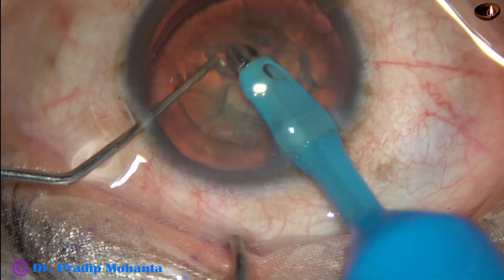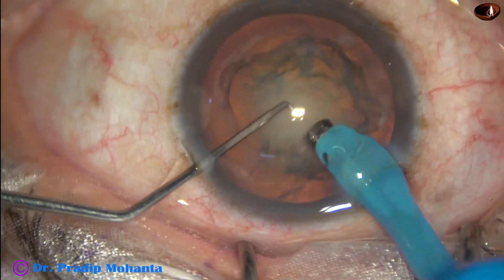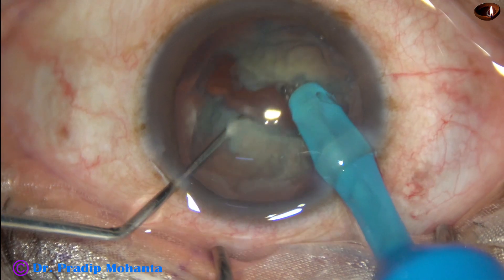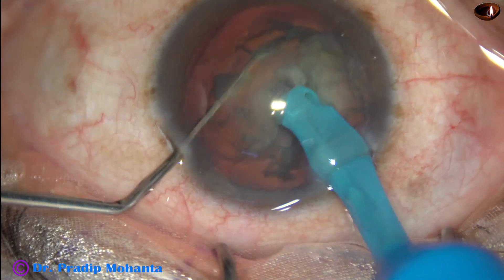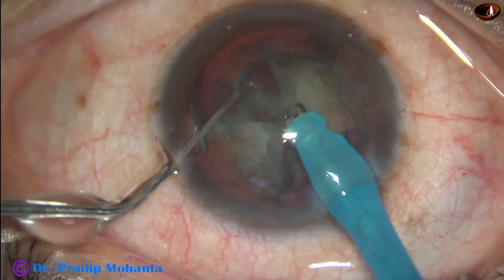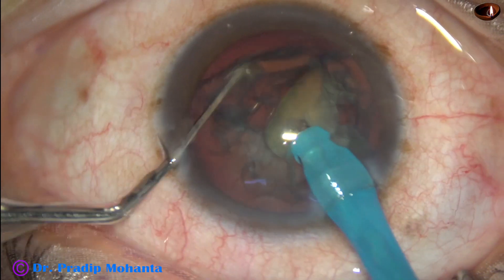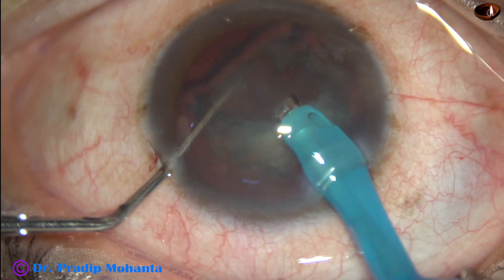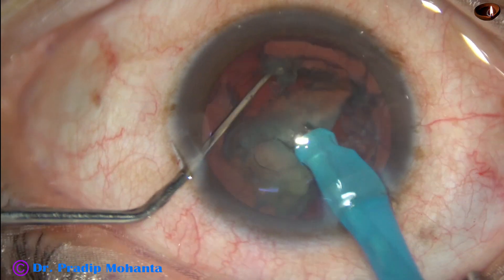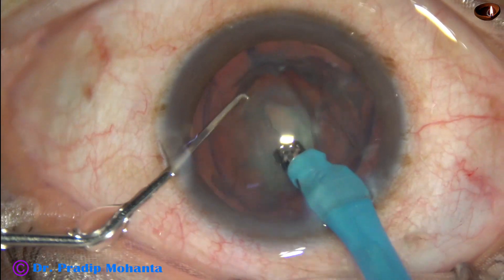Some superficial cortical lens matter is removed. Now the handpiece is turned to make the bevel off. The tip is buried into the substance of the nucleus and the nucleus is chopped into pieces. Each free nuclear fragment is emulsified with ultrasonic energy. Ultrasonic energy used in this case is 65 percent, flow rate is 45 ml per minute, and vacuum is 450 mmHg.